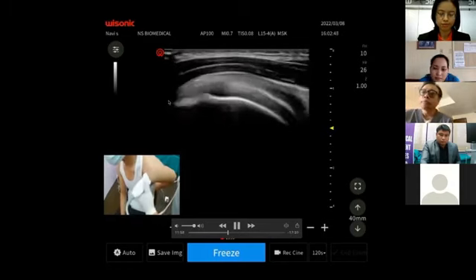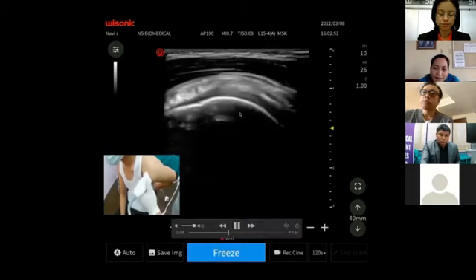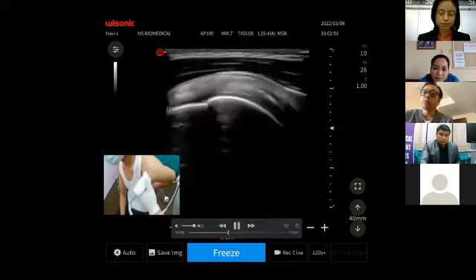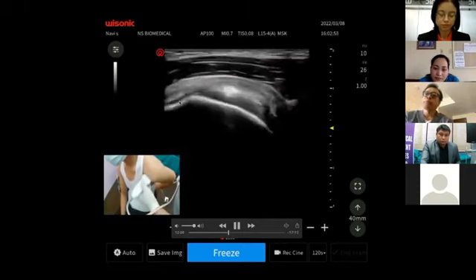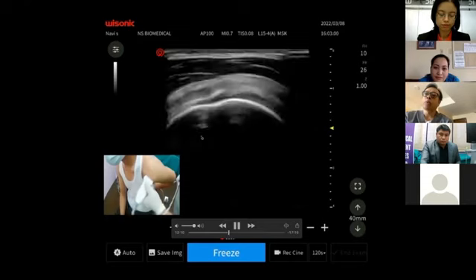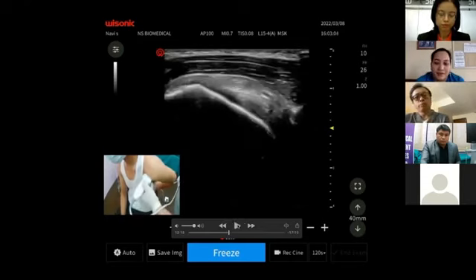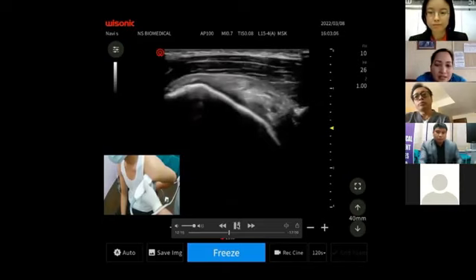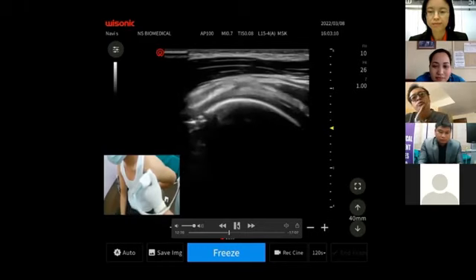Scanning supraspinatus posteriorly might be a little confusing when identifying the infraspinatus tendon. So there's an easy way of doing it. We look at our greater tuberosity. I'm sorry, I said greater trochanter, I meant the greater tuberosity. It has a sharp edge anteriorly, while when we scan posteriorly, it becomes rounded, as we can see in the scan.